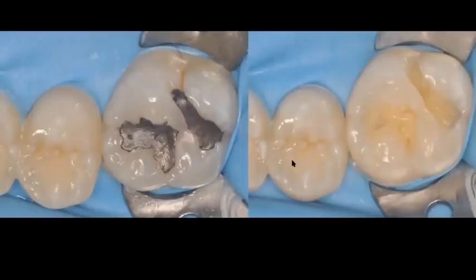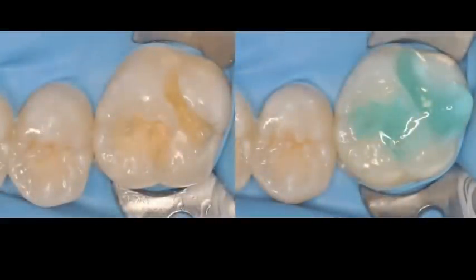Now, this is my second case with you. You can see a little bit more of a larger restoration. Now we have the lingual aspect of this molar compromised as well. So we're going to go ahead and remove the decay. We remove the amalgam, we remove the decay, and we go about acid etching. Again, in this particular case, we're using a total etch technique. There's enough dentin covering that pulp. There's nothing that we need to be careful with. So we're going to use a total etch technique.